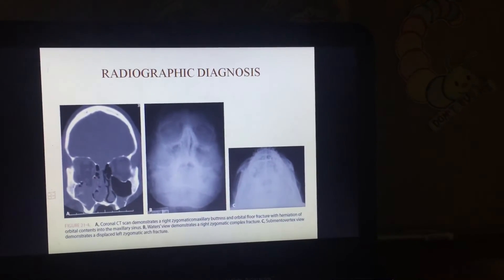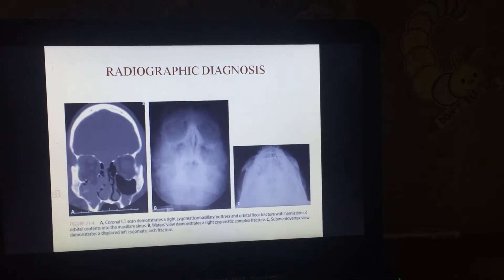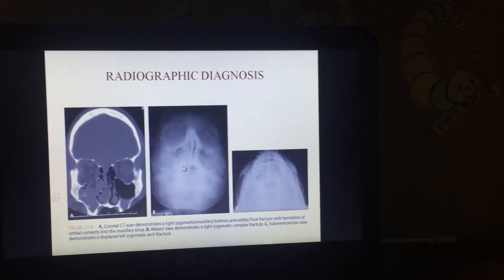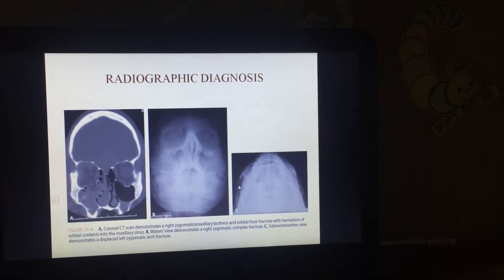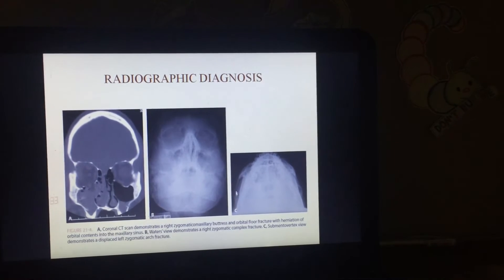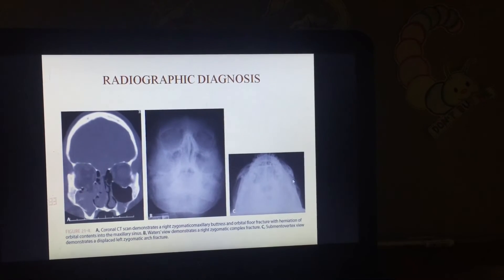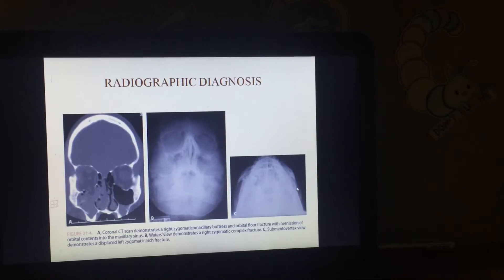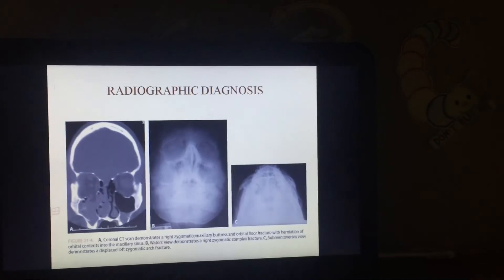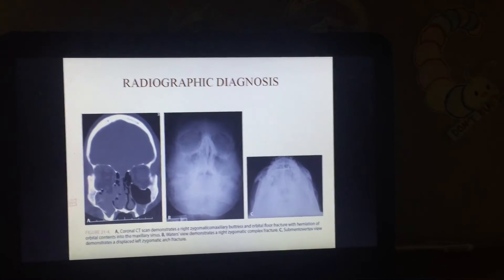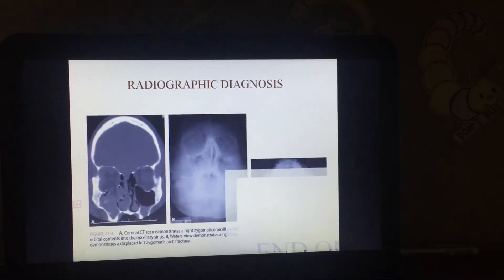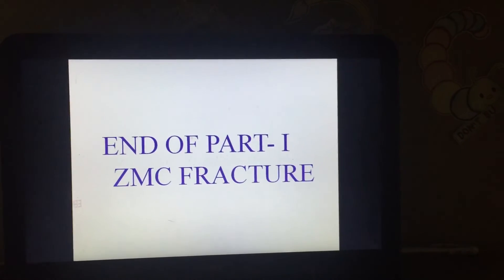Looking at the other radiographs — this is the CT scan image, this is the Water's view, and this is the submentovertex (cemento-vertex) view. Here we are able to appreciate the zygomatic arch, which appears slightly bent inward, indicating a fracture of the zygomatic arch. This completes the radiographic diagnosis, which follows the clinical diagnosis in establishing a complete diagnosis.